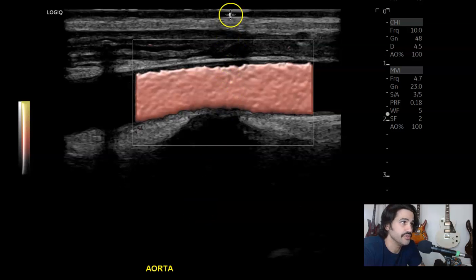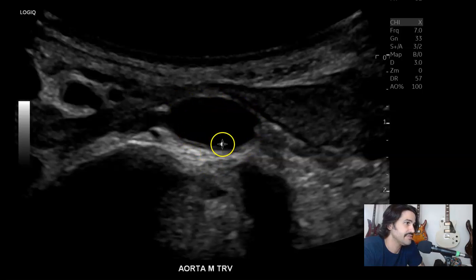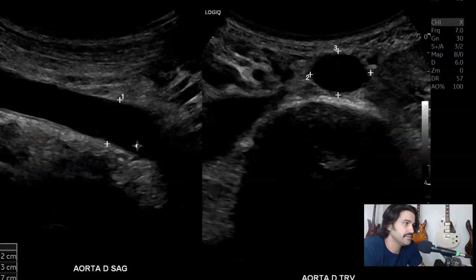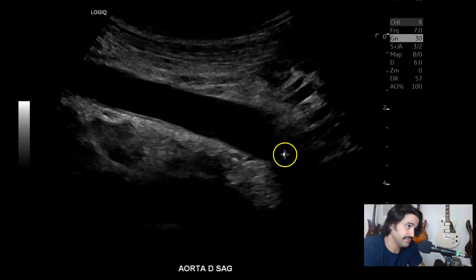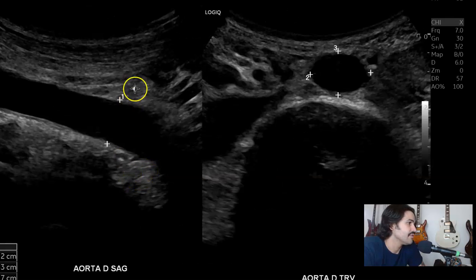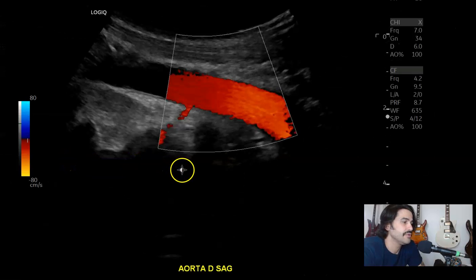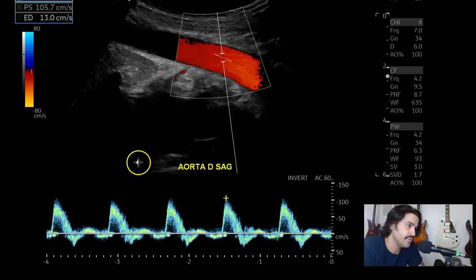You can see how close the aorta is to the surface of the skin — very slender. Then transverse, with and without color. And then distal — here you'll start to see the bifurcation, about at the level of the umbilicus. 1.2 centimeters, 1.2 centimeters — the same AP dimensions. The vertebrae and a little bit of the IVC. Distal sagittal with color, nice triphasic waveform.